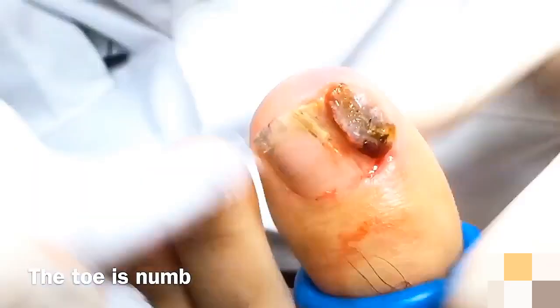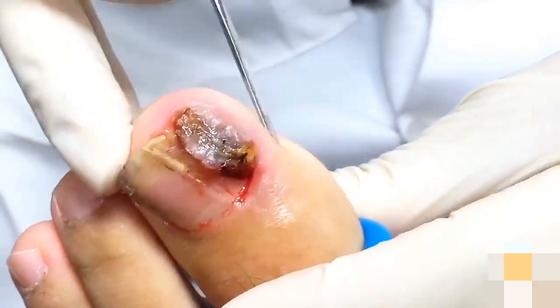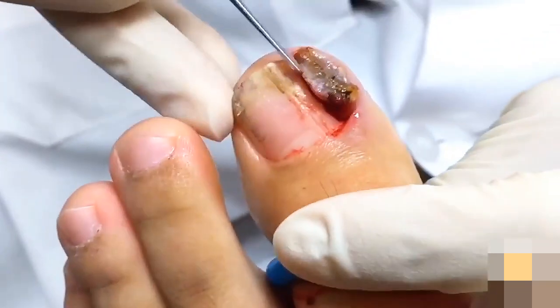I already numbed the toe, so we're ready to go. I'm going to check to make sure the toe is numb. Do you feel that, Jackie? Nope. It's all nice and numb.